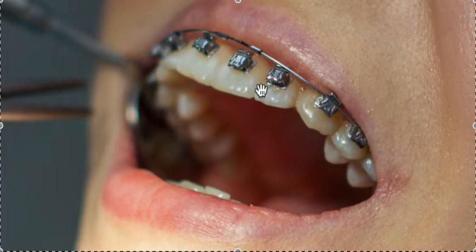If you're a spacing case, there's no benefit to self-ligating because you're going to need power chains anyway — which are rubber ties all connected — so there's no point, especially if you have to pay more.